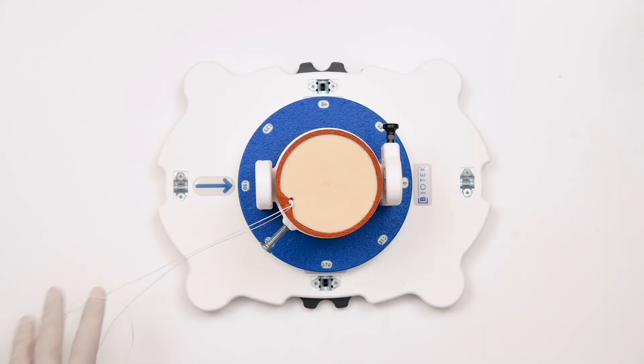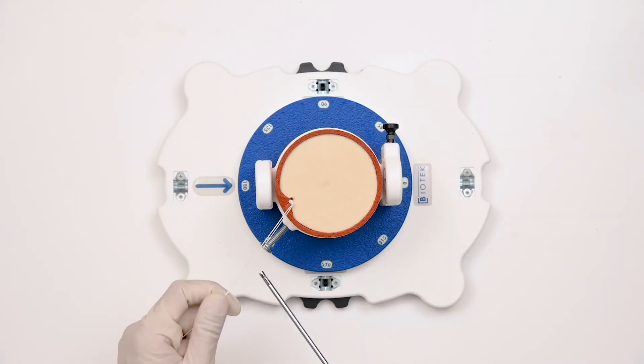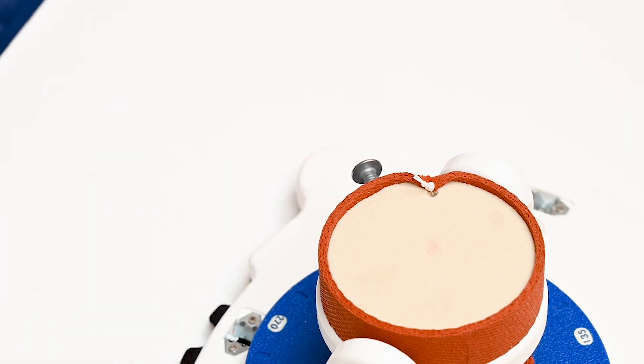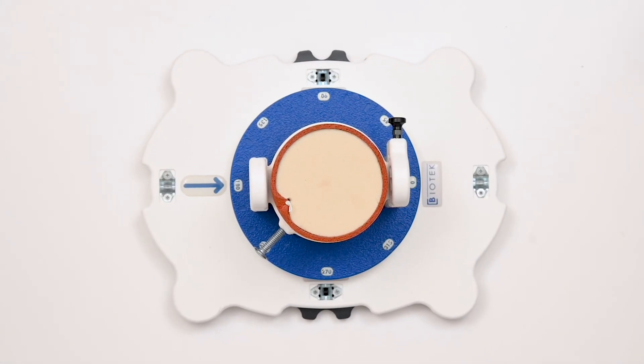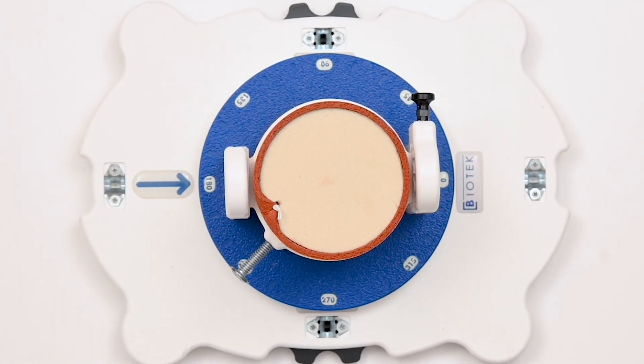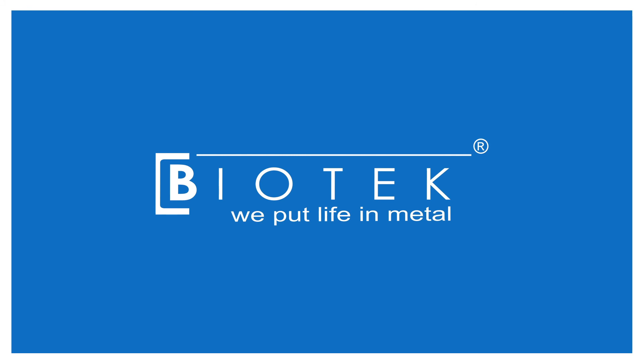After proper knots are passed, it is time to cut with the use of the suture cutter device.